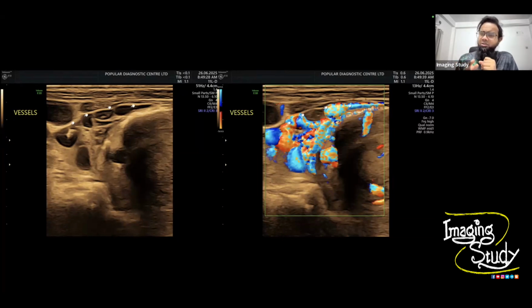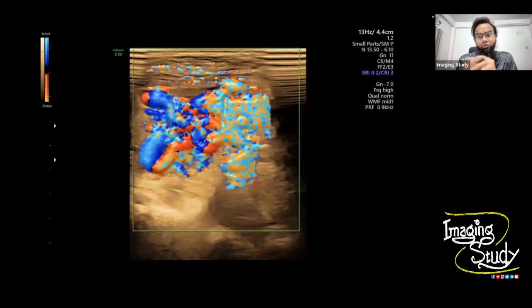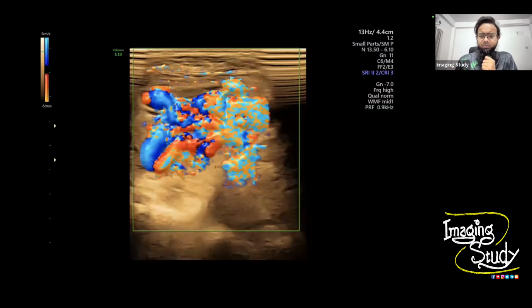Why did it happen? The causes may be different, but usually we focus on two things. Number one is multiple biopsies, which can cause this type of situation, where an arteriovenous communication may happen. The next one is a large sized mass which also has some necrosis inside, and that may turn into a communication between the artery and vein. So this patient has an arteriovenous shunt inside, and it is a very important feature we see in malignant cases. So an arteriovenous malformation has happened over there.